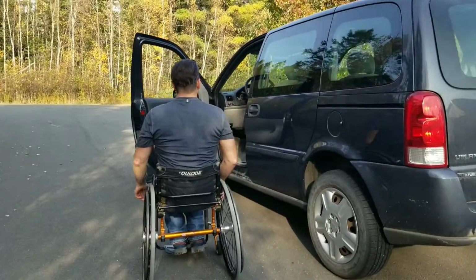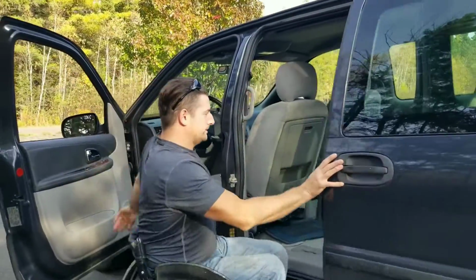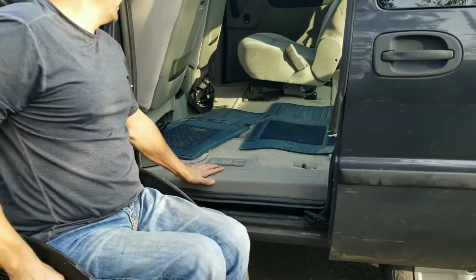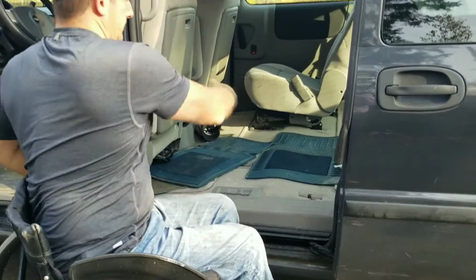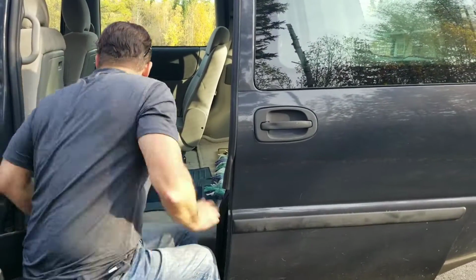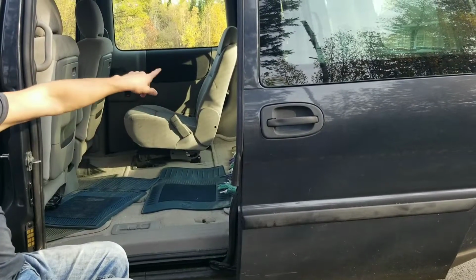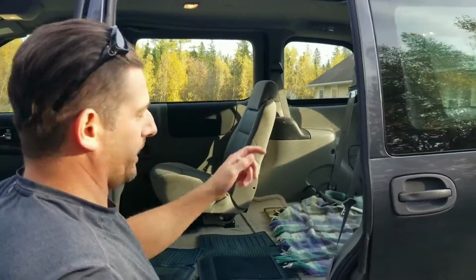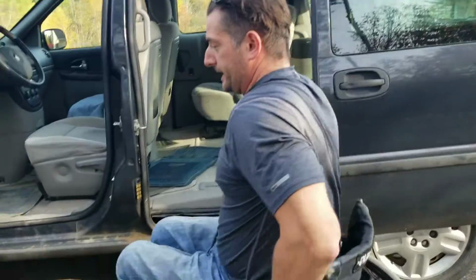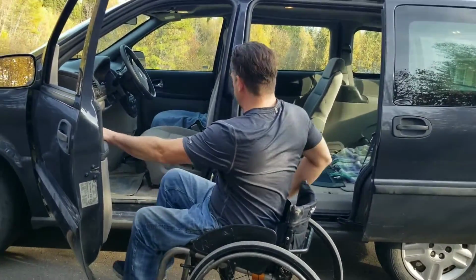So what I do now is basically, I open the door, I take out the passenger seat that's behind the driver's seat. I'm going to put this up here like that. It gives me lots of room. I can still put 2 seats in the back as well, so I can have 1, 2, 3, 4, 5 people and my wheelchair in the van. So this is what I do to get in now, and like I said, this is the safest way for me to get in and out of my vehicle now.